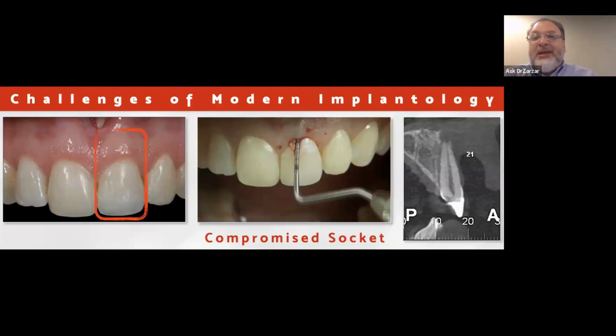I would place the implant, and with the open flap, I would see how the implant threads would be exposed. Then I would use, I know you're already smiling, granulated allograft, a bone graft, and then I would use a membrane to protect and fixate that bone graft.